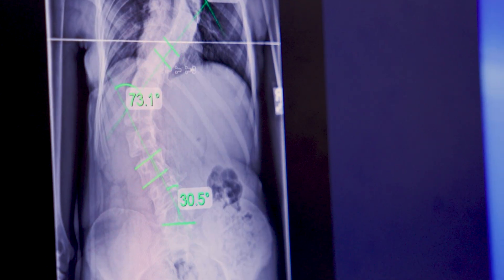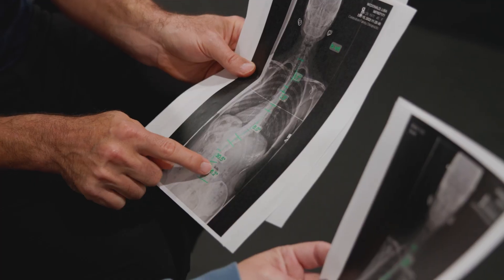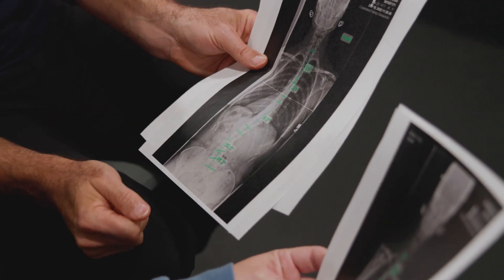The scoliosis X-ray can not only tell you the severity, but it is also the way to get an official diagnosis of scoliosis. X-rays tell you the majority of things you need regarding treating a patient with scoliosis and can help craft an effective and very customized treatment plan for that patient.